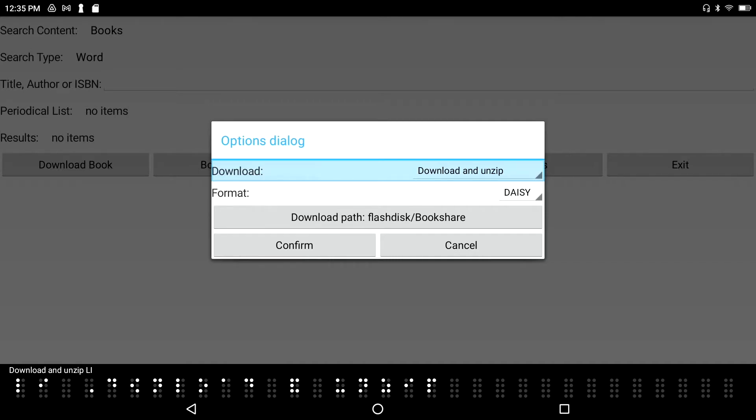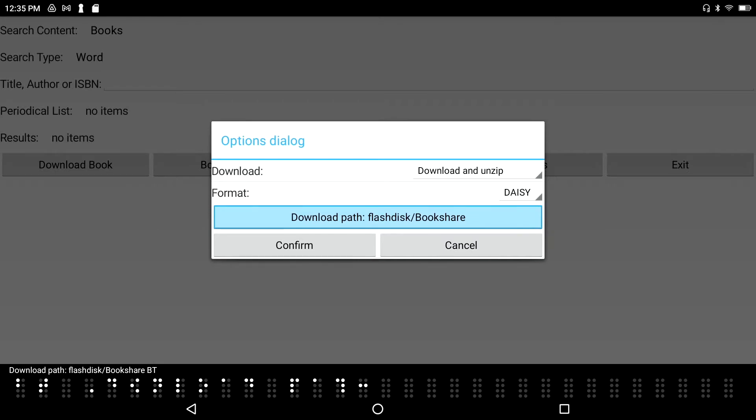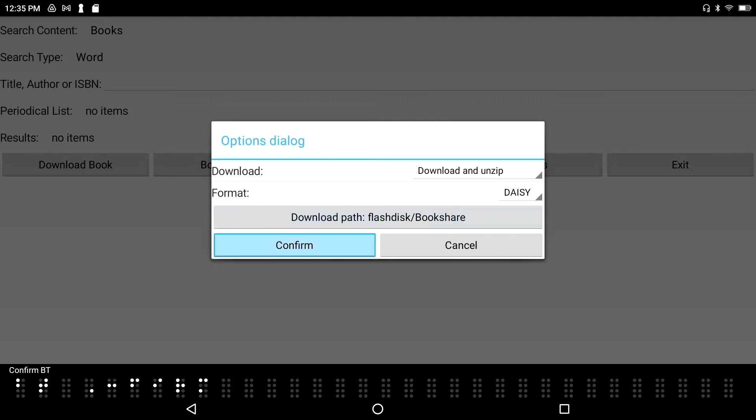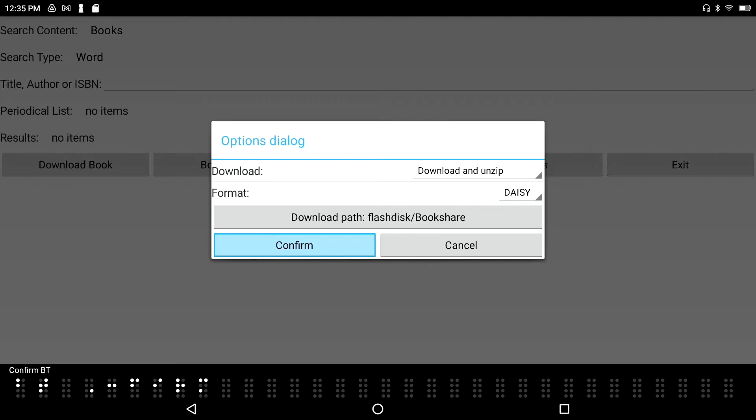I don't want to have it open just because I downloaded it. I'm going to tab again. Download path: flash disk, Bookshare button. I can select the path. The default path is the Bookshare folder and I'm going to go ahead and keep it there. Confirm. I'm going to press confirm, save options.